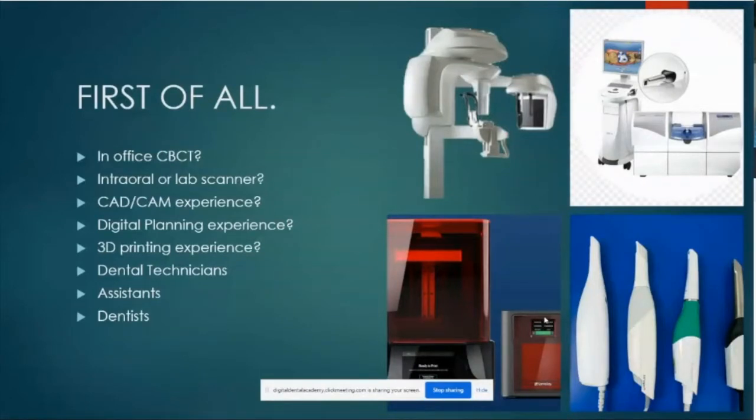There is another type of scanner as well, which are desktop scanners, where if you're very good at taking your impressions, you can continue taking your regular impressions, and from there, you can just take it to the desktop scanner. We just finished developing a desktop scanner at Blue Sky Bio that is about $2,500, which should be about 2,200 pounds. I don't know. And actually, it's designed in England, so it's pretty cool.